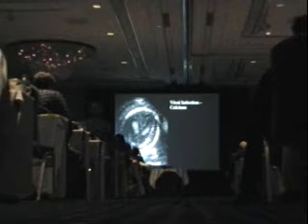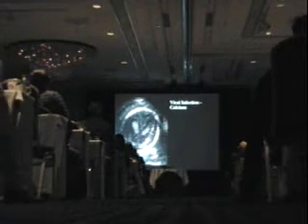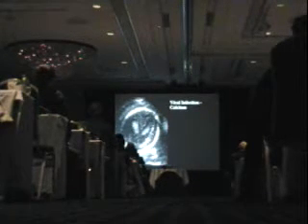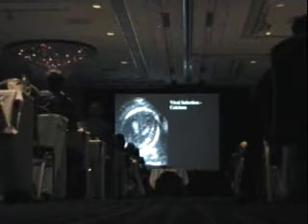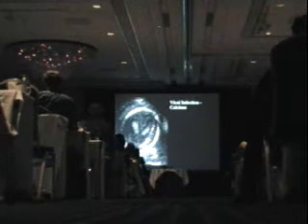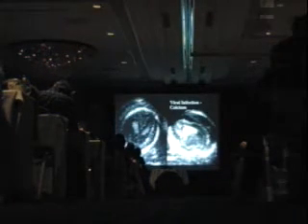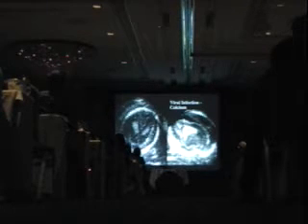And the reason that I can tell you that this was not the ventricles is because that's not where the choroid plexus is. The choroid plexus is always a great place to look for what the confines of the lateral ventricles is. And here is the choroid plexus right here. It does not go all the way out here, so this is not the ventricle. You can see exactly where that choroid is. There is no ventriculomegaly right now in this fetus.